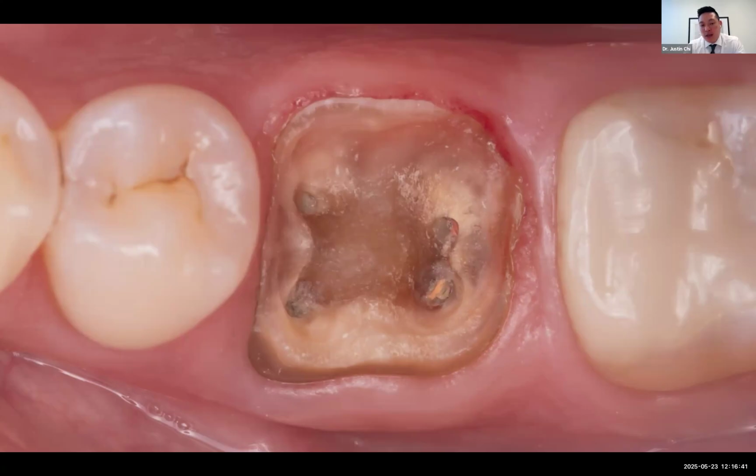But thinking about it like a bowl, it is like a bowl. So wider at the top and narrows toward the bottom. If you can visualize all of those internal walls, as with any good CAD/CAM indirect preparation, minimizing undercuts is also preferable. The finish lines I have are a butt joint on the lingual, on the distal. On the mesial buccal, there's a little bit of coronal tooth structure coming upwards. You can see it's more of a chamfer type preparation. So round-ended burrs are going to create that type of transition. So it's not necessary to make a butt joint all the way down. That would really entail flattening all of the tooth structure around the margins. So that's not really necessary.